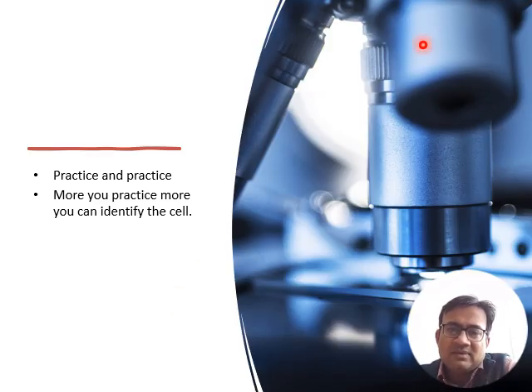For all this practical, you have to practice and use the microscope. The more you practice, the better you will be able to identify the cell properly.